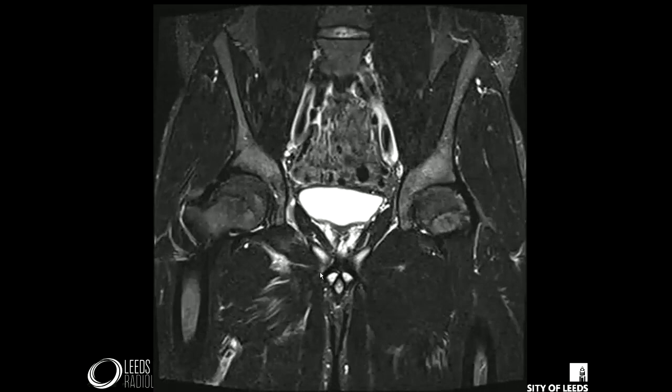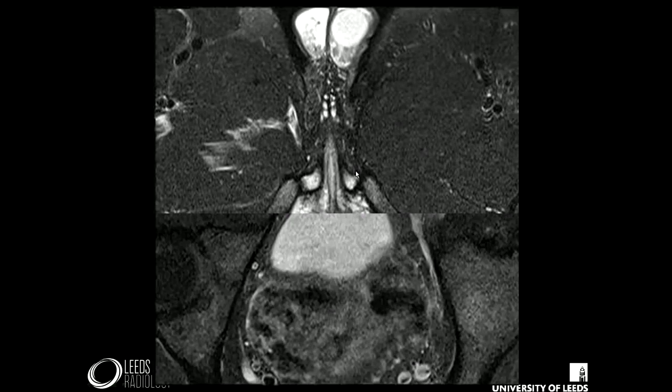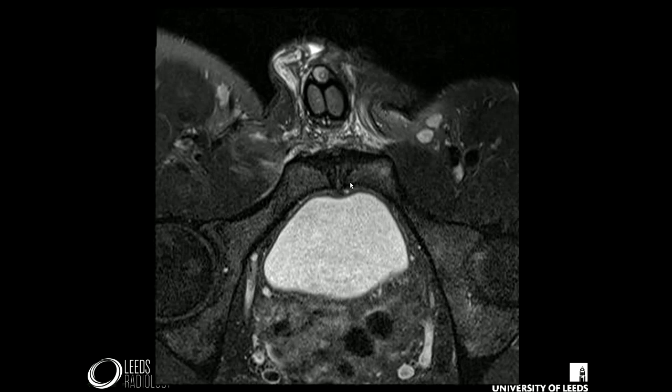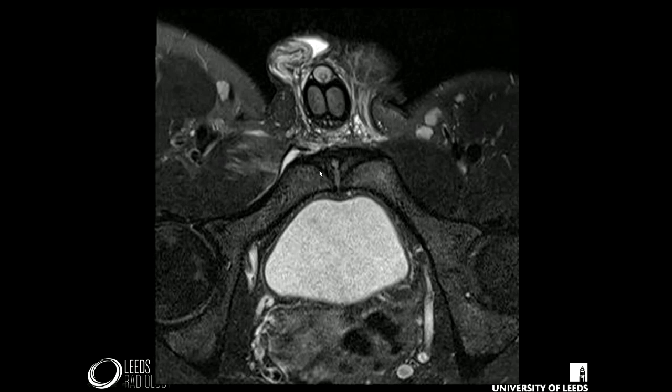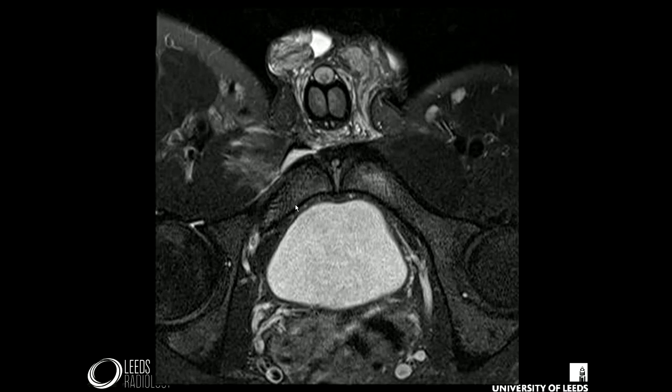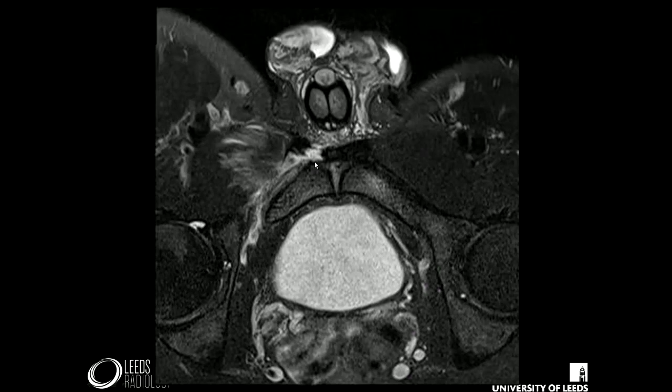In the oblique axial view of the same player, the pubic bodies are relatively normal, but the attachment and mergement of the capsule and adductor muscles have stripped away, stripping into pectineus. There's detachment of the capsule and the adductor — not just the adductor, but the capsule tissues have also been disrupted.